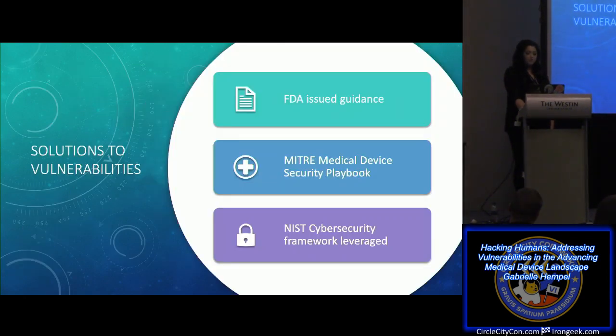So what are our solutions to these vulnerabilities? The FDA has issued guidance, both pre- and post-market, to offer recommendations for management of medical device security risks. Mitre unveiled a medical device security playbook in October 2018. This enables healthcare organizations to plan for and respond to incidents and develop a preparedness and response framework.